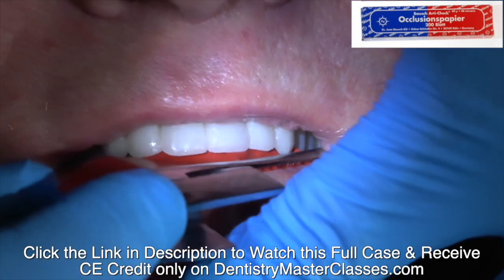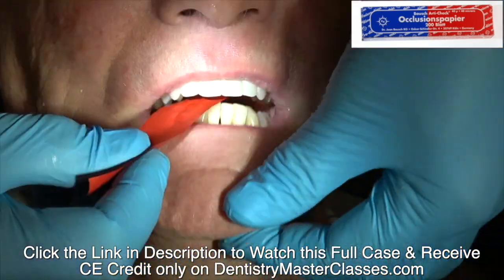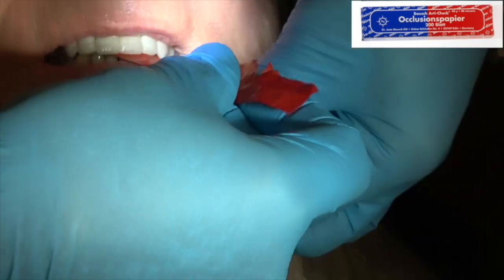Check the occlusion. Have them bite down lightly initially in case there's a high spot — you don't want to fracture the lithium disilicate or any of the rest of the bridge.